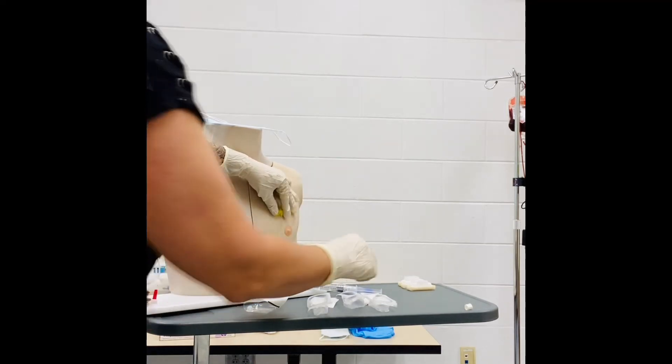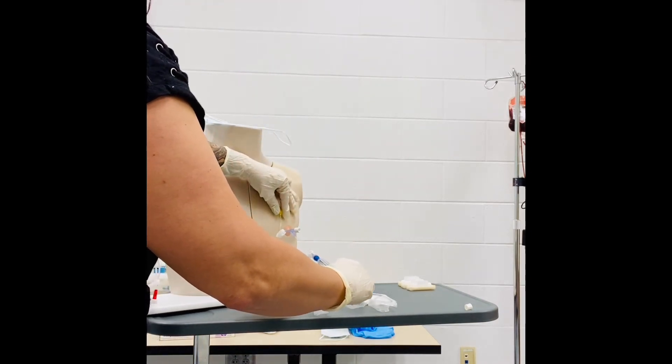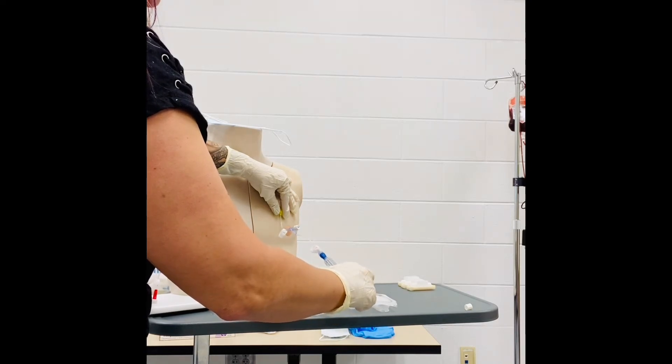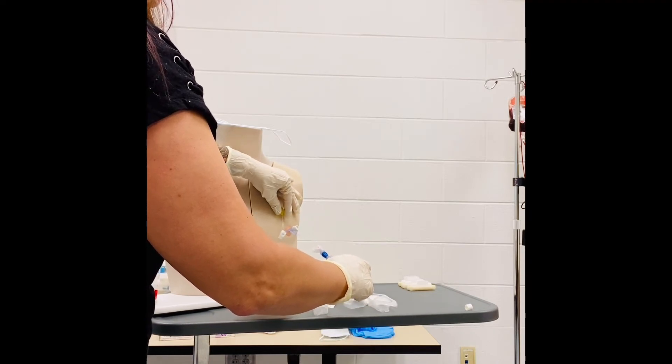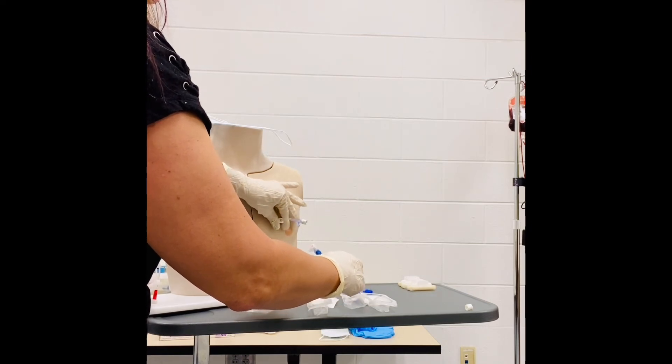Once you have that, you just want to keep it stable, ensure your locks are open, and you can pull back. Then begin to do your push, pause, push, pause, push, pause, and then you'll want to lock that off at the end to maintain positive pressure.